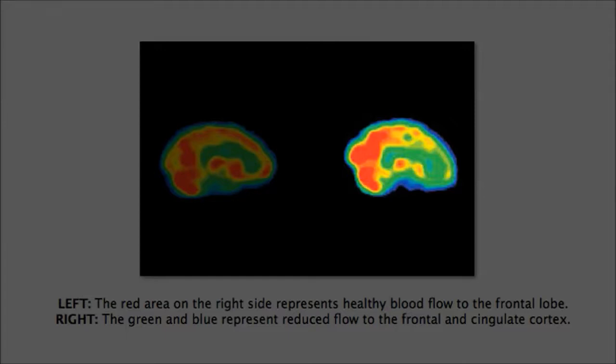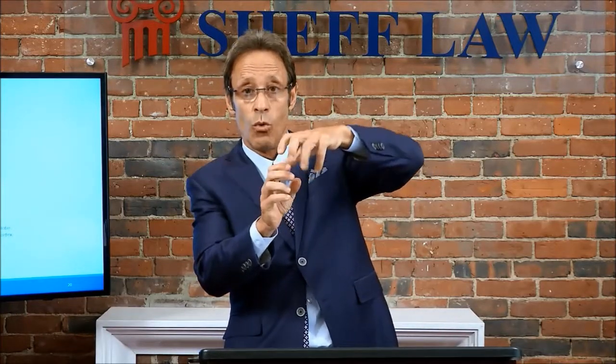One of the things we talked about earlier was the two kinds of shearing. Remember, the outside cortex shearing against the inside of the skull versus the twisting along the brainstem, along the axis, where this fragile gelatinous material that comprises our brain is particularly vulnerable as well. That can injure some of the midbrain structures, and those structures are very easily visualized by PET scan, especially favorable for that kind of damage.